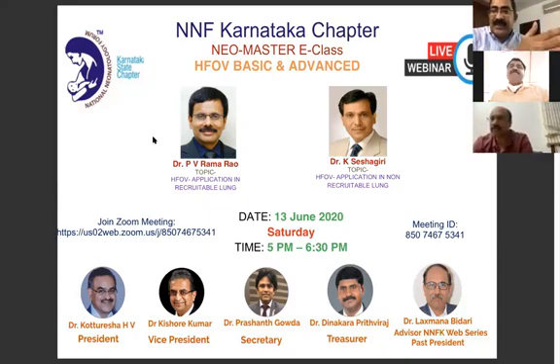So that means 33% inspiration and expiration time is obviously 67%, right? So that 1:2 ratio is changed, let us say, to 50%. That 33 has come to 50. That means inspiration to expiration is equal. That means you are driving the lung more.